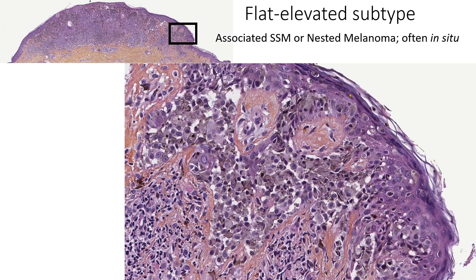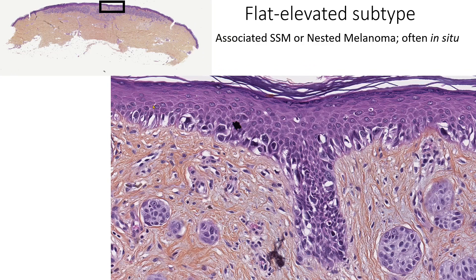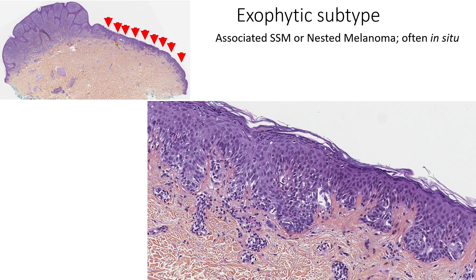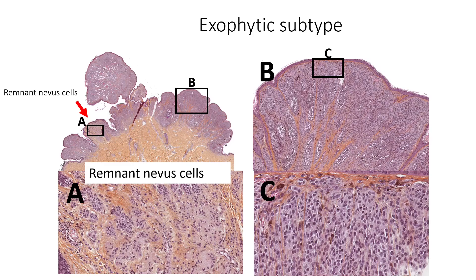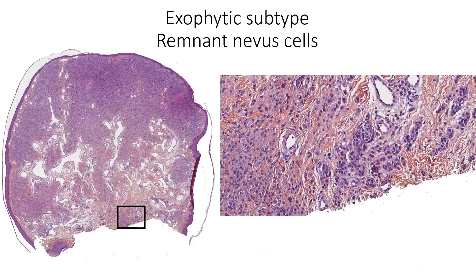Here are some examples: a pagetoid scatter of pagetoid cells in one case, or just a junctional lentiginous component. Some other examples show a really asymmetrical distribution. In some cases we will find small remnants of nevus cells, often with very focal distribution.